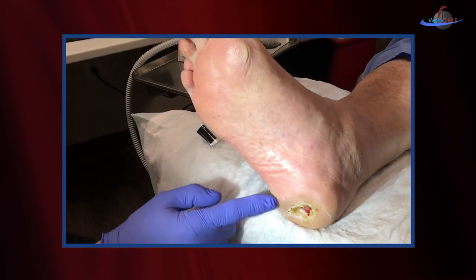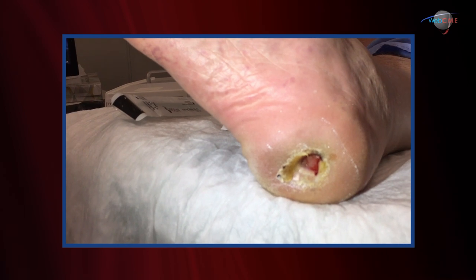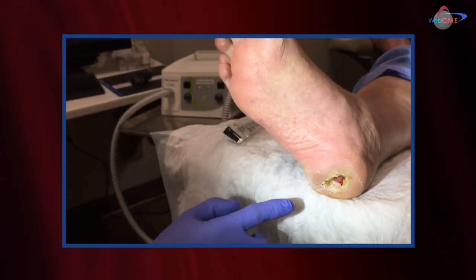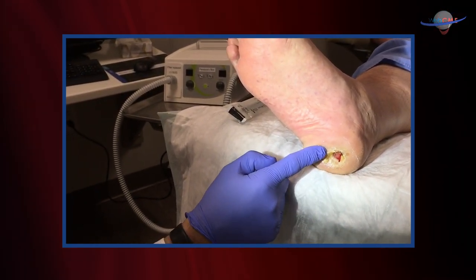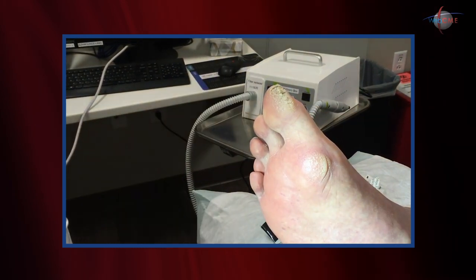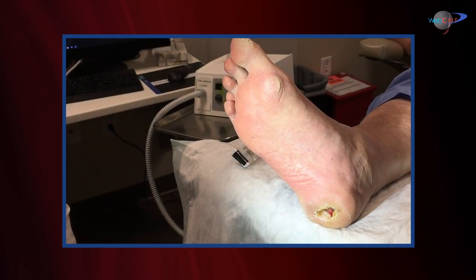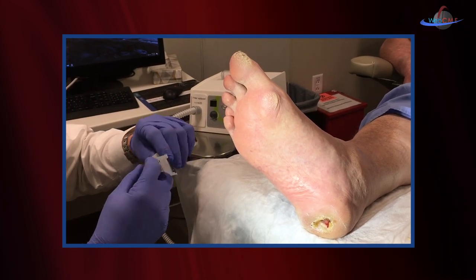This patient has developed a diabetic foot ulcer — it's a Wagner 3 with some underlying osteomyelitis. He's on aggressive antibiotic therapy for that. We're treating the wound in our standard fashion. Notice there's significant callus buildup around this wound, which is part of the problem. He also has some callus developing here, truly related to inadequate offloading. We're going to address that with a total contact cast, but first we'll start with some debridement of the callus.